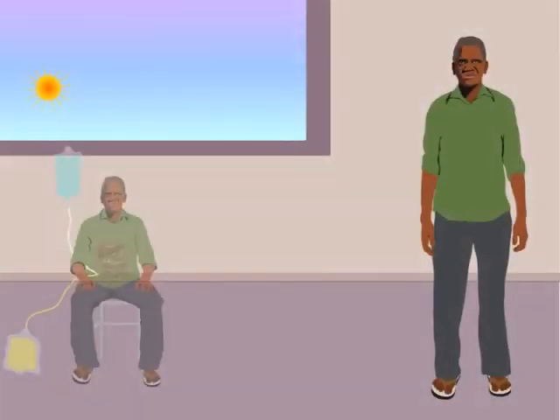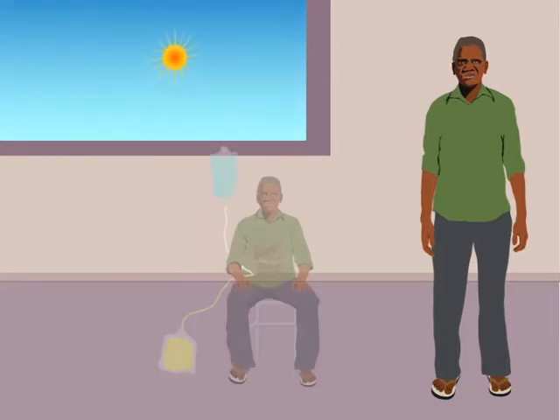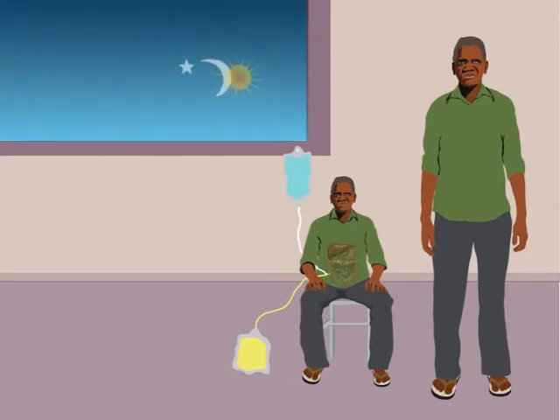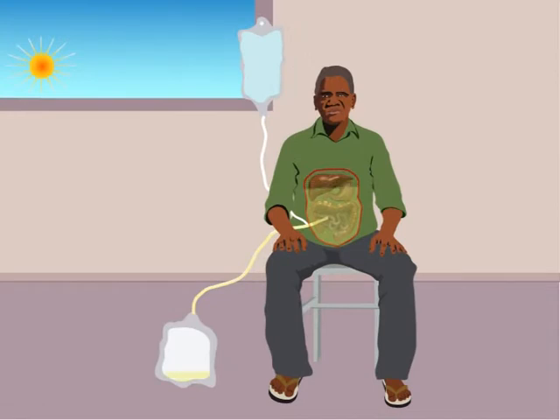If you do PD during the day, you have to fill and empty the bags 4 times a day every day. So maybe early morning, midday, afternoon, and nighttime. You only have to sit there for 30 minutes while you empty the used water and fill up with cleaning water.